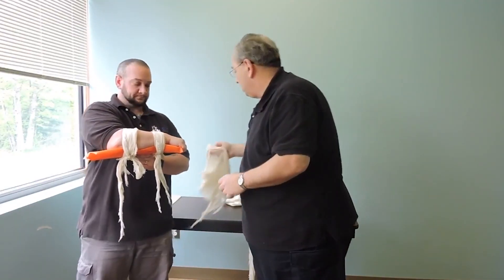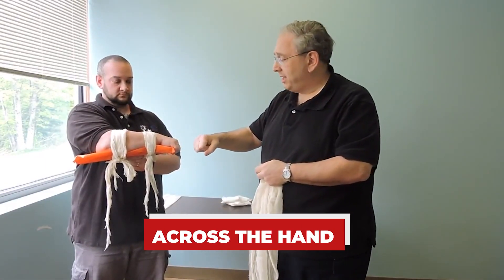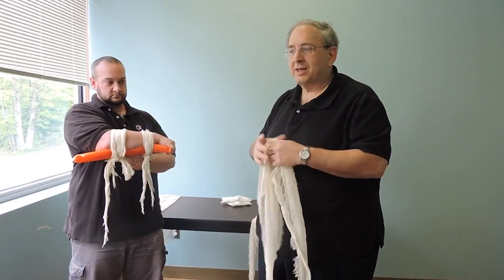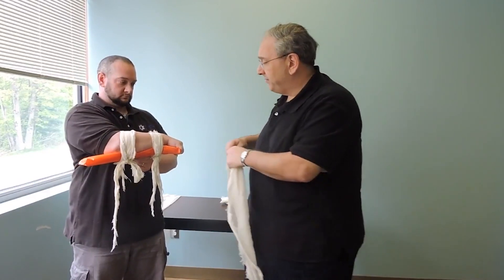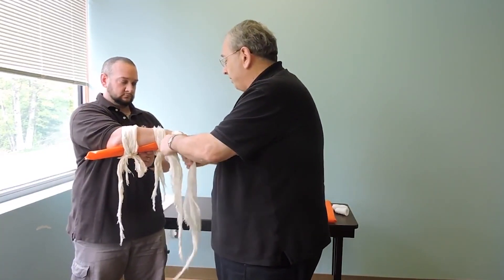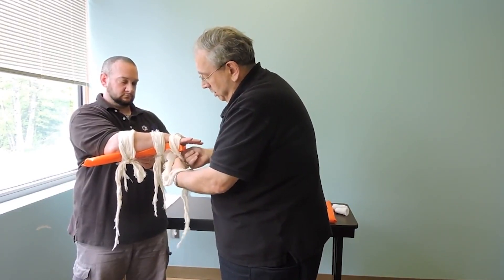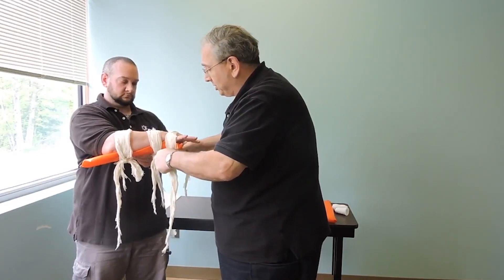I want a third cravat to go across the hand. The reason is I don't want that patient moving his hand, because every time he moves his hand, that broken bone's ends will rub together and start destroying tissue, nerve ends, and blood vessels. I'm going to loop it through — I want to put it through the thumb, not over the thumb. Tie it underneath against the board. I'm using a surgeon's knot; I don't need it super tight, I just need it to be snug.